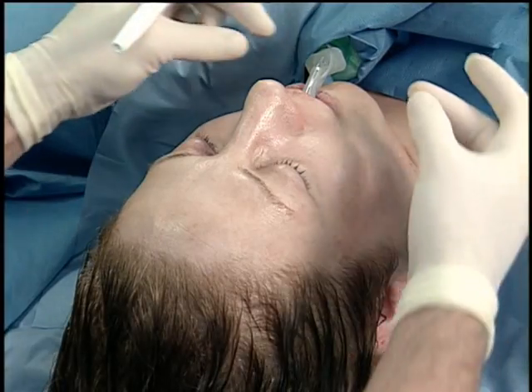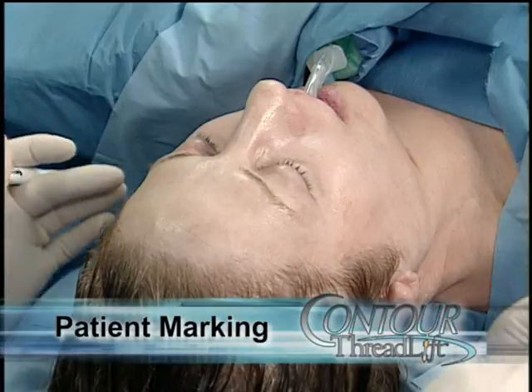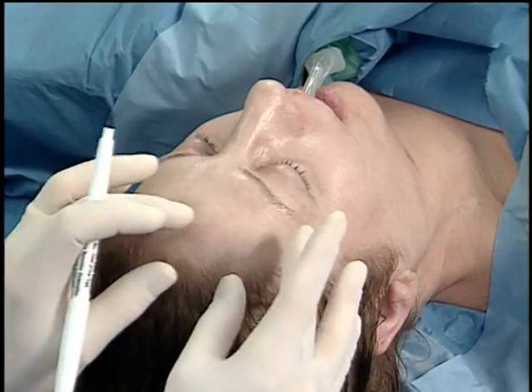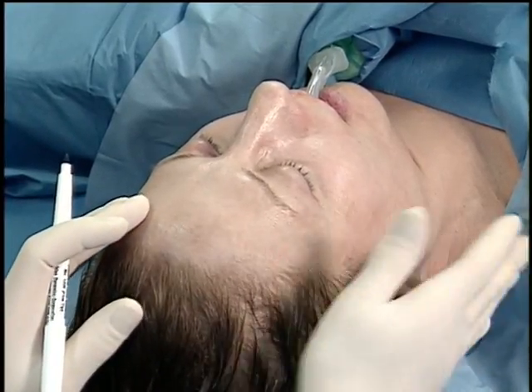Normally, I do these procedures with the patient under local anesthesia only. This patient is having some adjunctive lower lid procedure done and is under general sedation, general anesthesia. During the marking, we're going to mark the brow, the cheek, the jowl, and the neck, each zone.